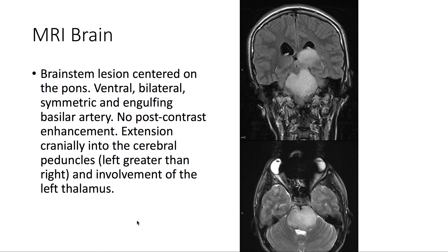Taking a look at the MRI of the brain — here the FLAIR image — we note a brainstem lesion centered on the pons. It's ventral, bilateral, symmetric, and engulfs the basilar artery. There's no post-contrast enhancement, and there's extension cranially into the cerebral peduncles, left greater than right. There's also involvement of the left thalamus.